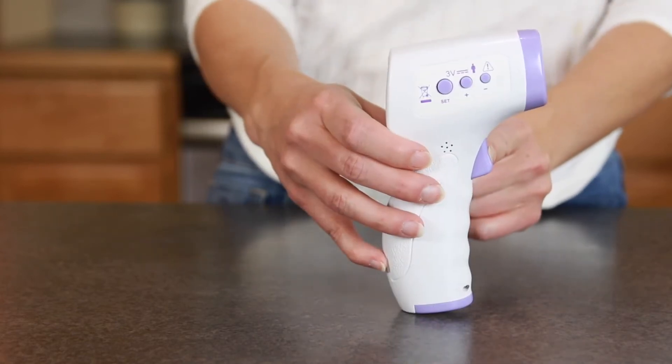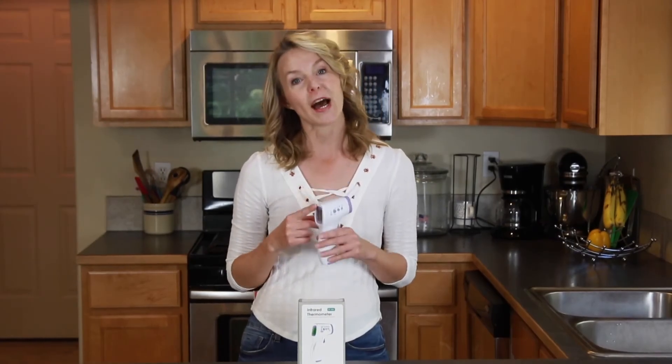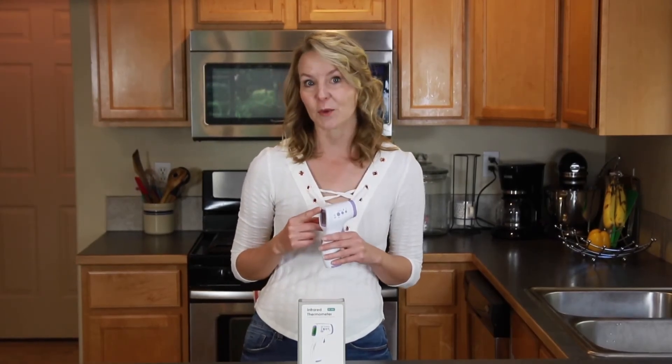To use it, press the trigger button here and you will see the display light up. You want to keep the thermometer in a draft-free place away from direct heat sources, and it's best if you keep it in the testing area for 10 to 30 minutes before you plan to use it, so it can adjust to the ambient temperature.